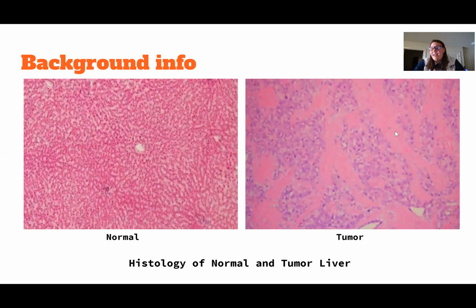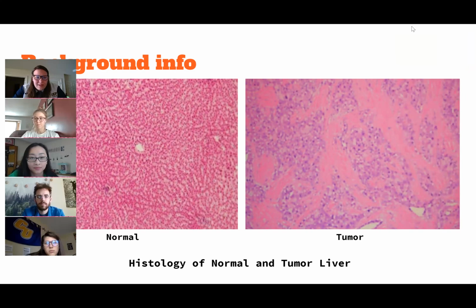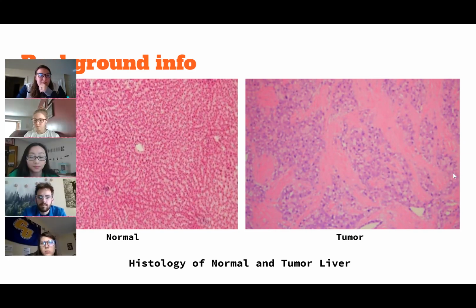So part of what makes FLHCC unique is the histology. This is something that we've talked a lot about, and I'm sure that you guys have heard, but we're going to review it one more time. The histology that really sets it apart is all of that collagen banding in the right picture. As you can see on the left, you have a very uniform looking liver and cell pieces, whereas on the right, it is broken up by the collagen. This collagen sets it apart not only from normal livers, but also from livers that are affected with HCC, which is a subset of liver cancer.